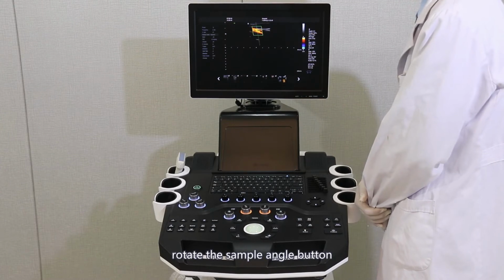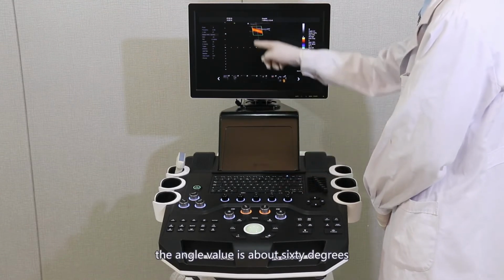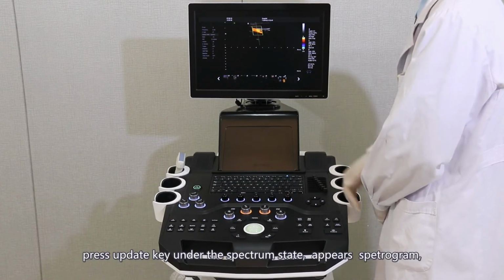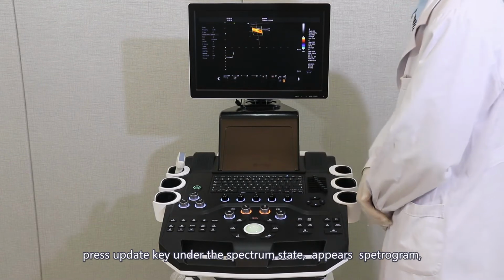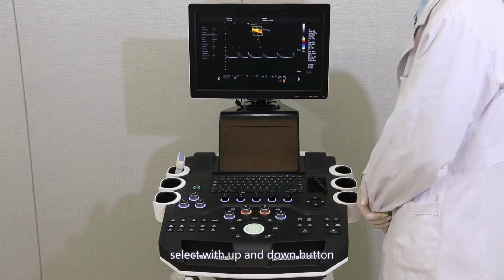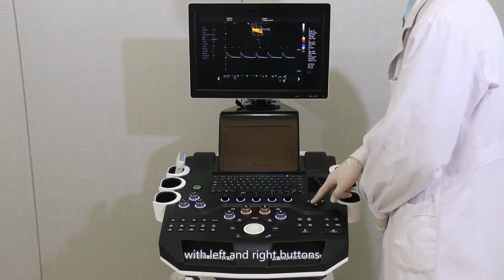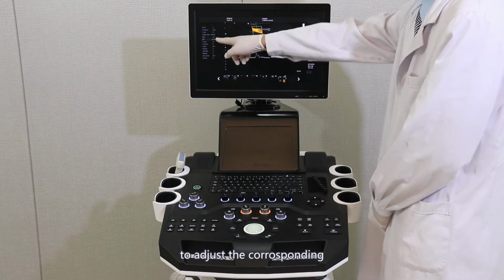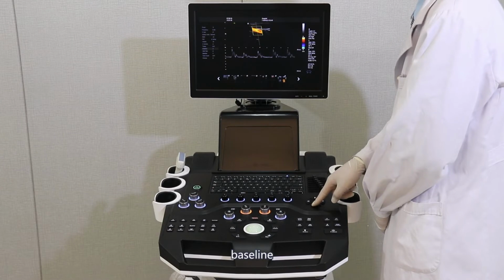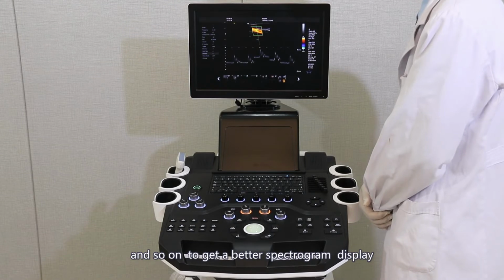Rotate the sample angle button to adjust the size of the sample angle. The angle value is about 60 degrees. Press the Update key under the spectrum state. The spectrogram appears. At the same time, select with the up and down buttons. Adjust the parameters with the left and right buttons to adjust the corresponding PRF, baseline, and so on to get a better spectrogram display.